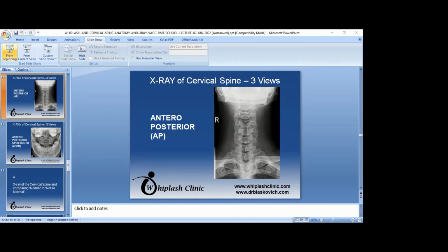because there's a lot more logic in explaining to the class what conventional X-ray looks like and how it can be used. What I do with the fluoroscopy is at a level that isn't very mainstream, and there's not a lot of utilization of it, even though it's extremely valuable in diagnosing injuries properly.